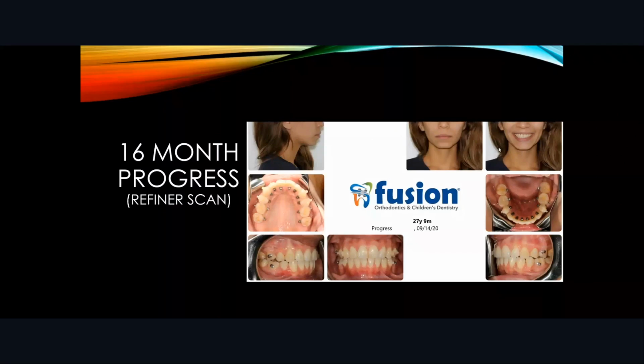Now, there's an explanation to be given here. For example, you see that molar on the upper right side is a little bit tipped. This used to happen a lot with the original versions of the brackets. These were speed brackets that have been discontinued for the past year or two. But the speed brackets had some play with the arm, so it allowed these kinds of tippings to happen at the time for extraction cases. But that problem has been resolved by switching to custom brackets that the company makes.